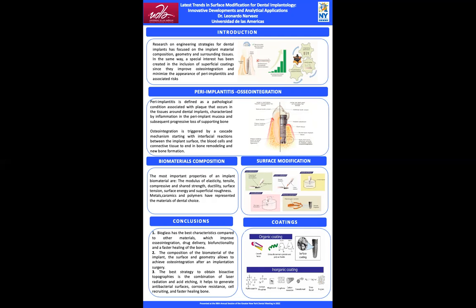As we can see in the picture, the demand for dental implants has increased due to their aesthetic and functional characteristics. 90% are successful after 10 to 15 years of implantation, but the 10% fail because of mechanical causes, periimplantitis, or bacterial colonization, which has increased the search for innovative materials that end the problem. To better understand this article, I will explain some concepts.